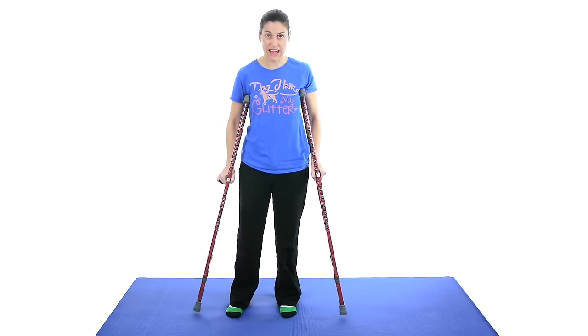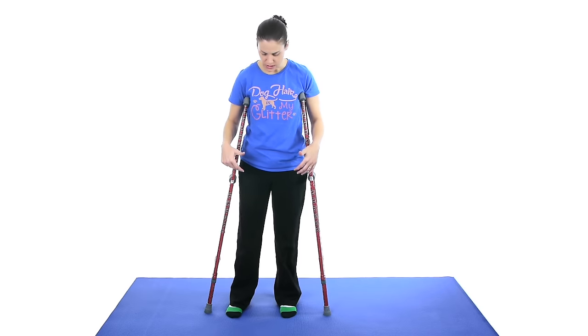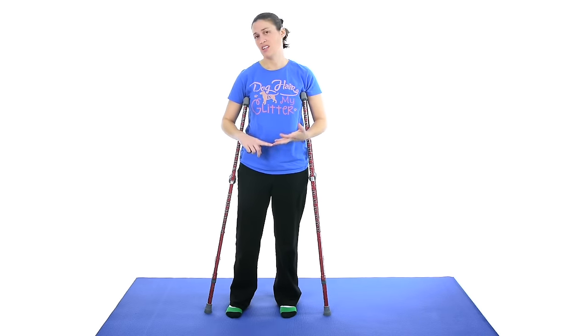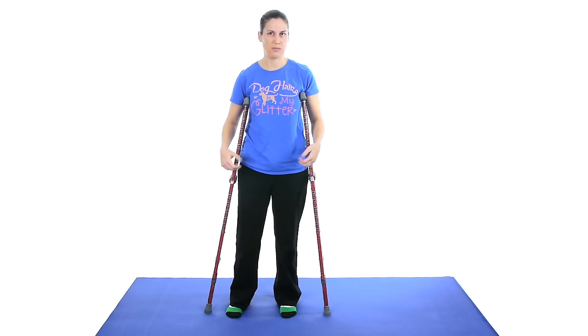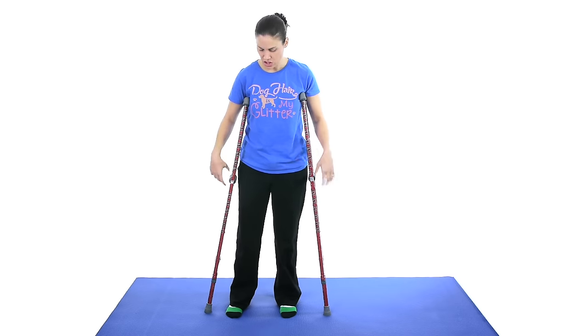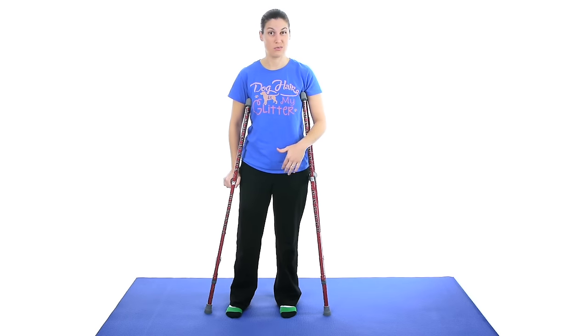So once you have all that in place, you get to the walking part, and there's different types of weight bearing for people when they're doing crutches. You're non-weight bearing, you can be toe touch weight bearing which is about 20% of your body weight. You can be partial weight bearing, and then weight bearing as tolerated where it's just kind of helping give you a little bit of balance. So the first one I'm going to show you is non-weight bearing, and then we'll kind of progress from there.